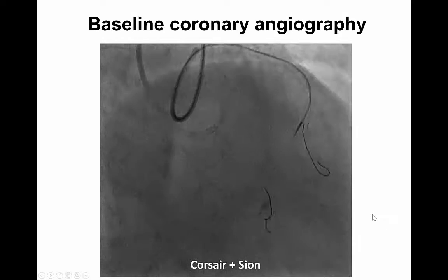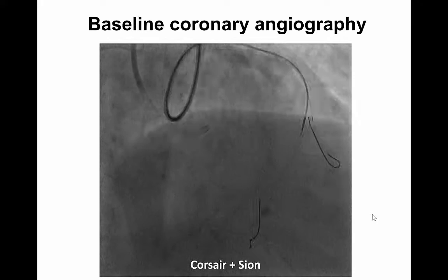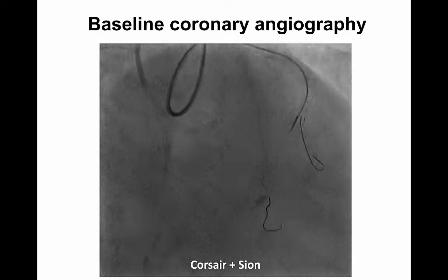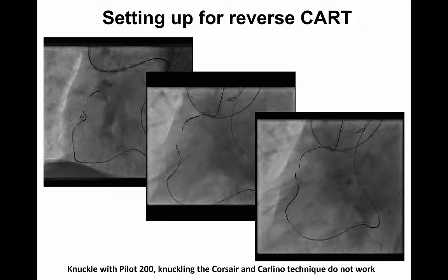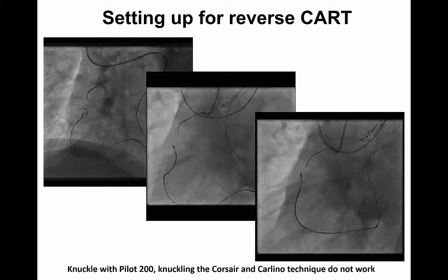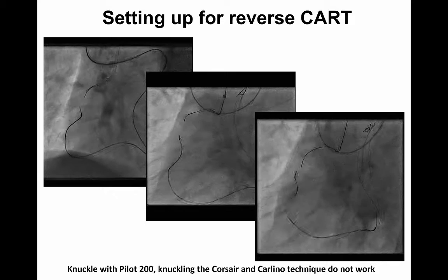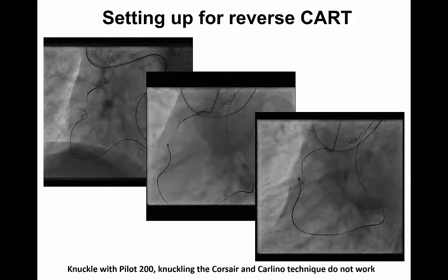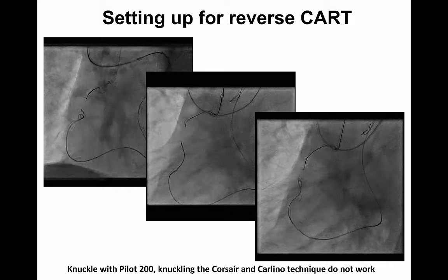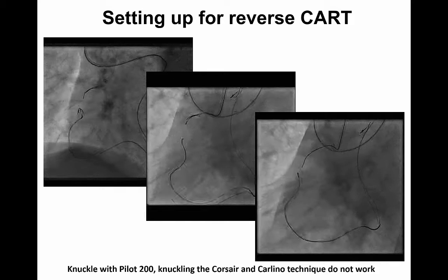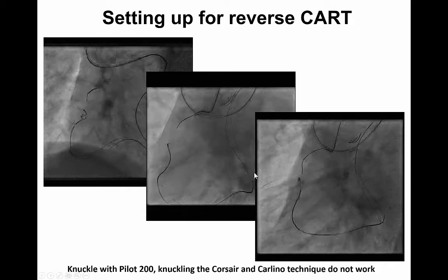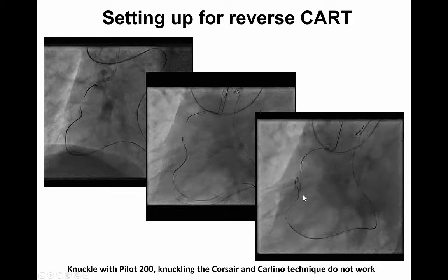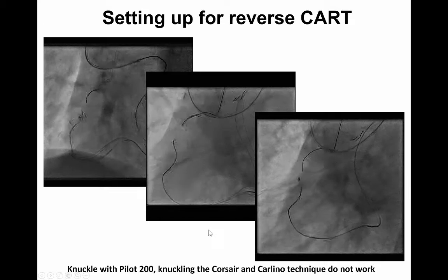This is a Corsair microcatheter plus a Sion wire surfing the septal collateral, going all the way back into the distal RCA, and then we set up for reverse CART. However, we encountered a spot of very focal resistant tissue — probably calcium — that could not be overcome. First we tried with a Pilot 200 wire that was knuckled, then we knuckled the Corsair itself, and we also tried the modified Carlino technique with a retrograde contrast injection from the microcatheter in the mid-RCA. Nothing worked.